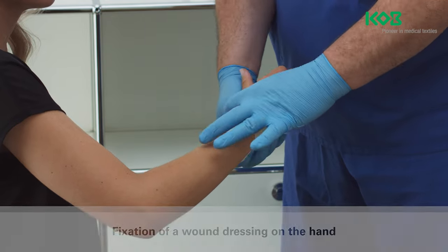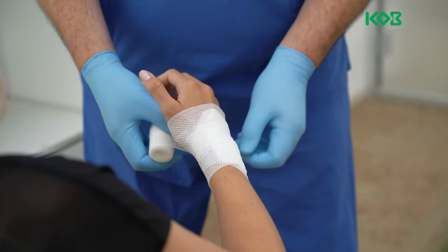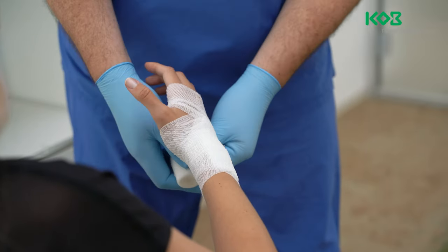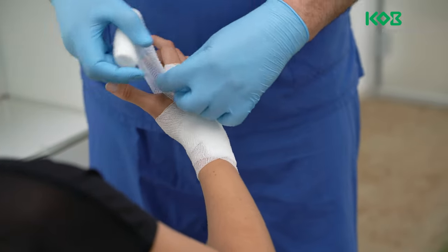Wrap the bandage around the wrist two times, starting on the outside of the wrist. Then wrap the bandage over the back of the hand, under the fingers and then back again. Wrap the bandage under the wrist and repeat the process diagonally over the back of the hand, the fingers and then back again. Repeat the process.